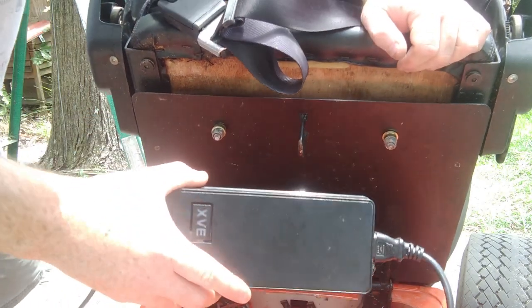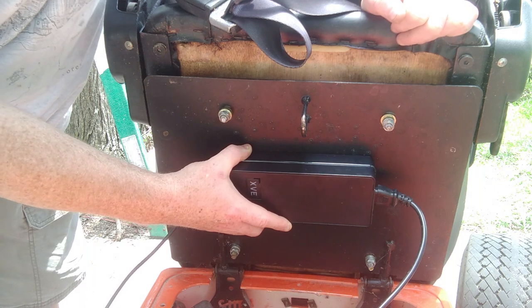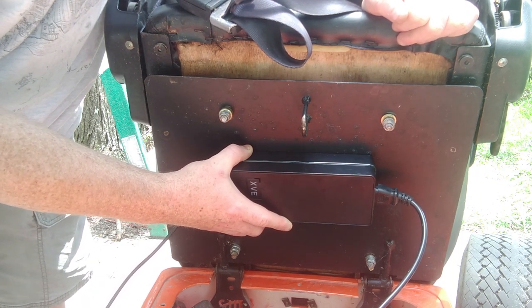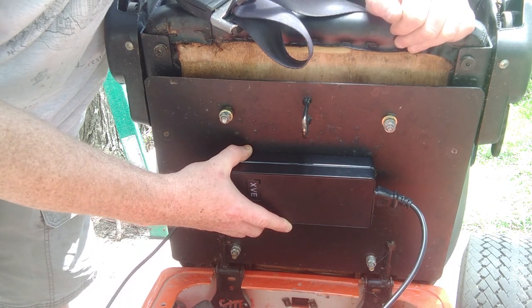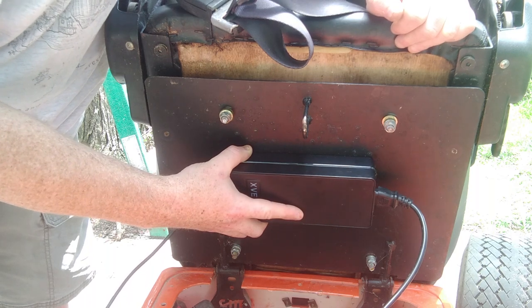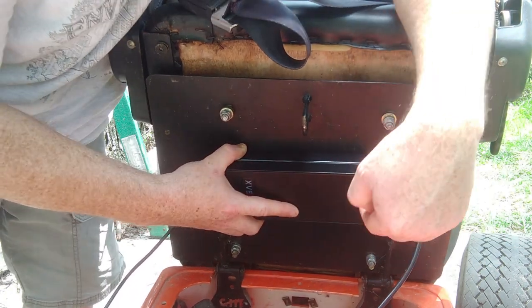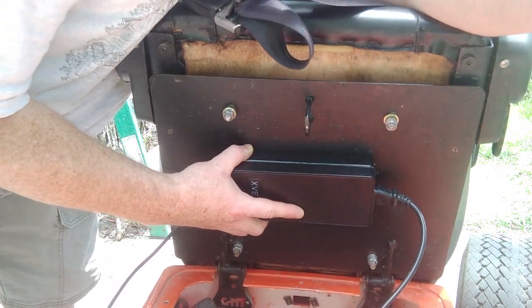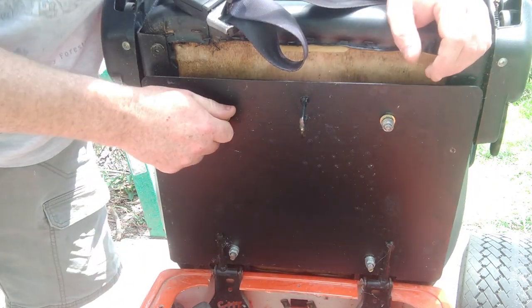So here's the charger, and I'm going to mount it right to the bottom of this metal plate on the seat. It'll keep it up and out of the weather, and it'll also keep it against the metal which will hopefully help reduce the little bit of heat this thing puts off. I'm going to use Velcro to secure it, but also drill a couple of holes and run some zip ties through those holes. That means I've got to take the seat off, so that's the next step.